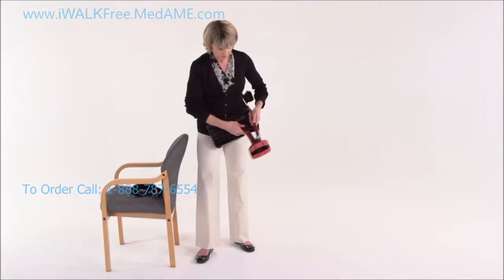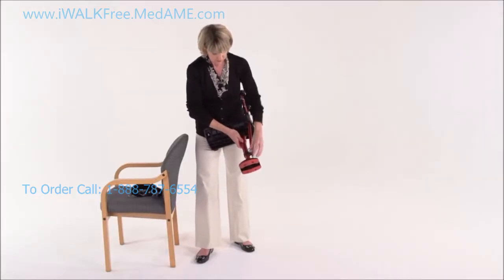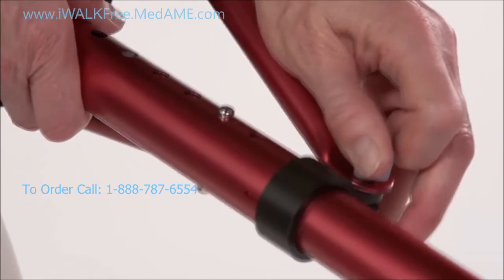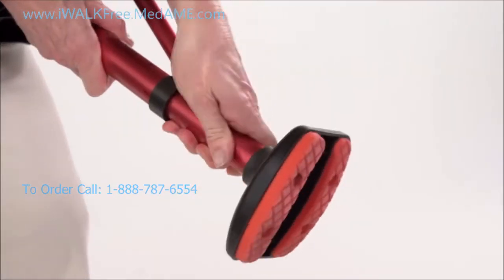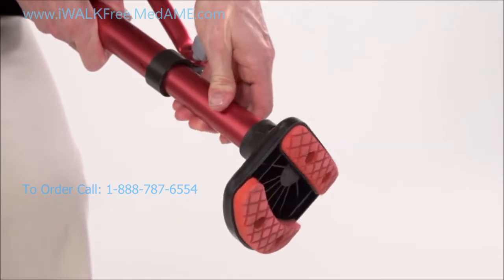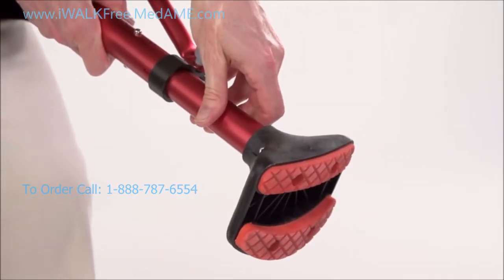Changing from right to left is simple. Just loosen the clamp bolt, push in on the double-headed spring, and rotate the foot 180 degrees until its spring head snaps into the holes. Then re-tighten the clamp.